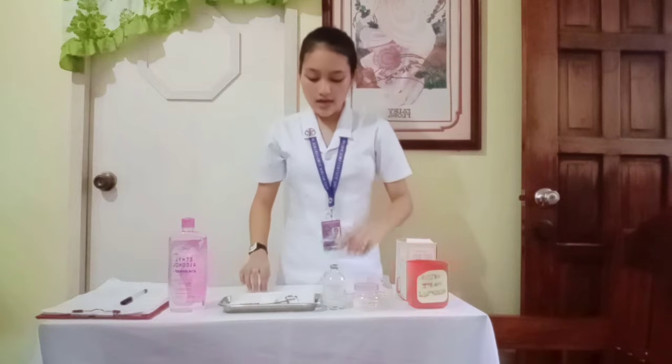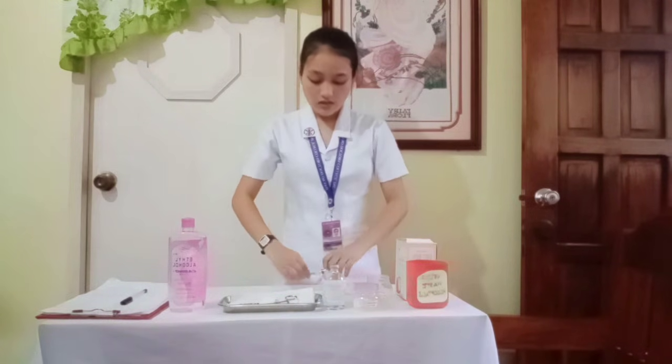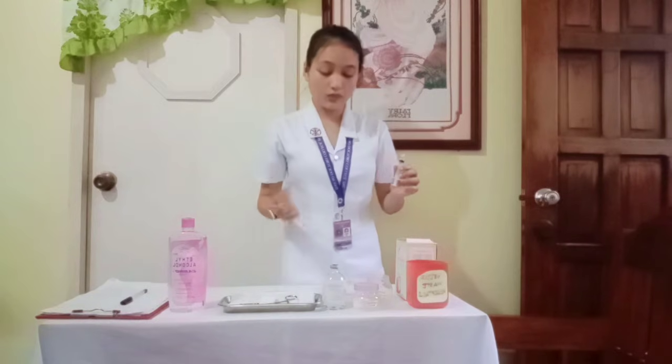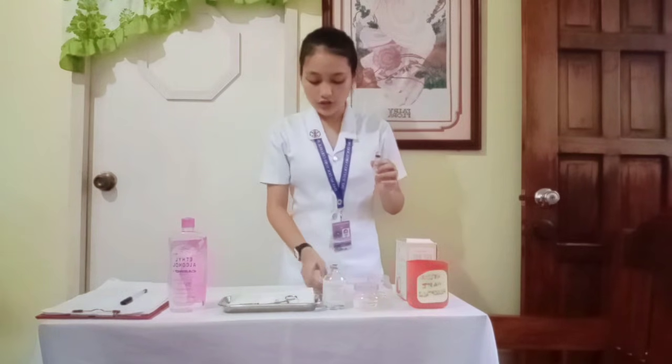Now what we need to do next is to remove this aspirating needle and replace it with a gauge 23 needle that will be used in the actual administration of this intramuscular injection.